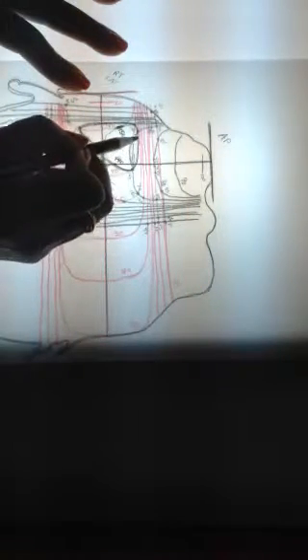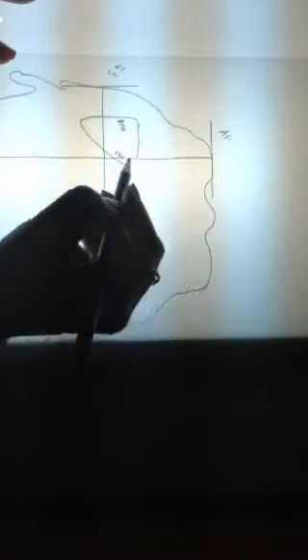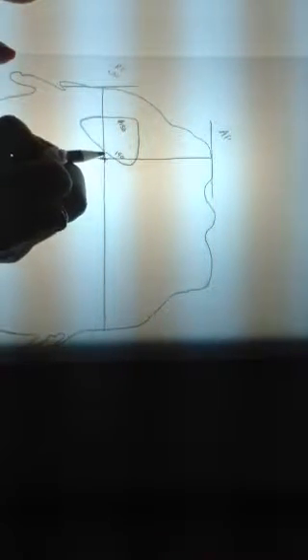So I could connect those points and put them into this contour. Now without the underpage, this is what the 140% isodose line would look like if I were to do two beams, one with AP, one with lateral, intersecting here. Again, don't forget to line up your isocenters each time if you're going to do multiple layers. Here's my 150% isodose line.